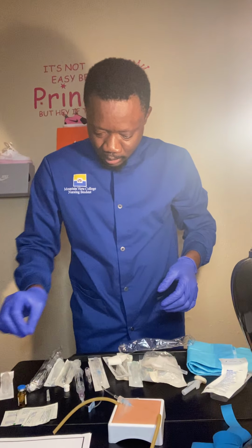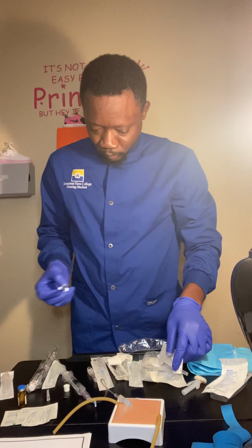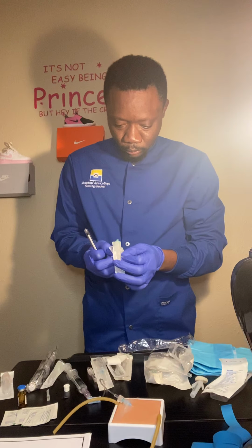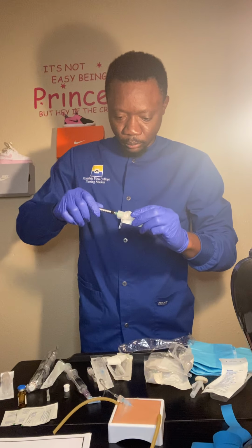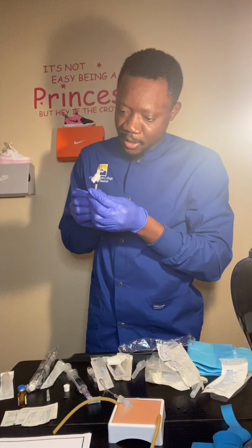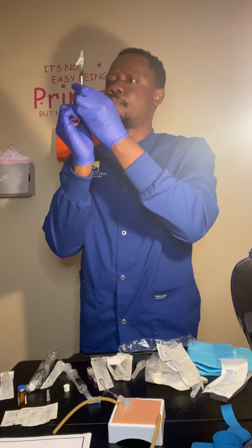Okay, so I get my syringes, making sure that I maintain the sterility. Okay, I will draw a 0.5 air.